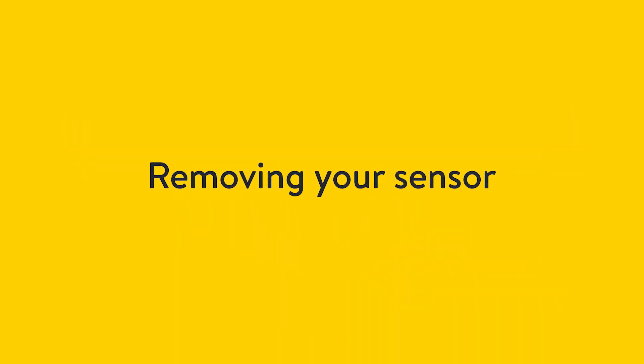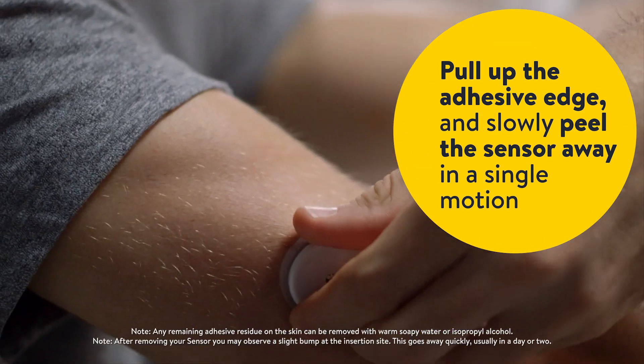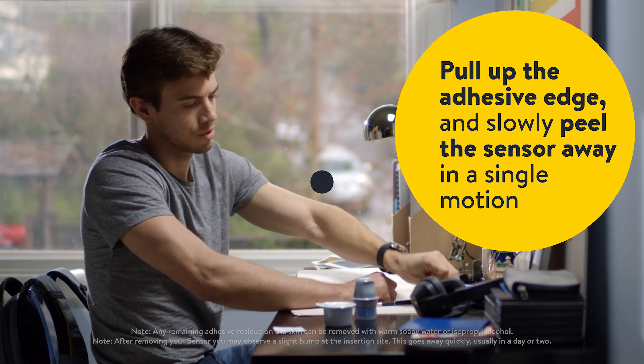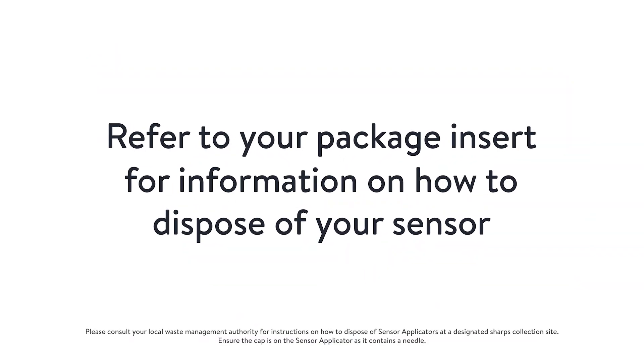Now we'll show you how to remove your sensor. Pull up the adhesive edge and slowly peel the sensor away in a single motion. Refer to your package insert for information on how to dispose of your sensor.